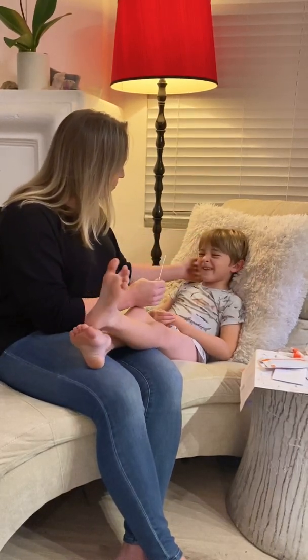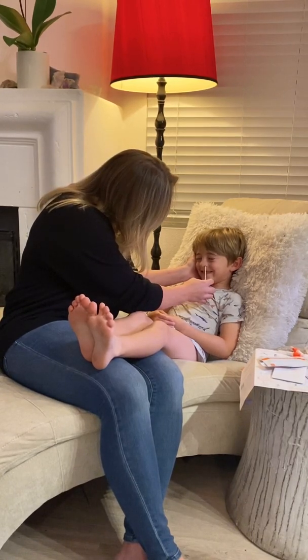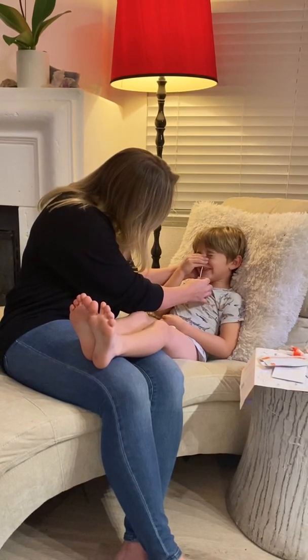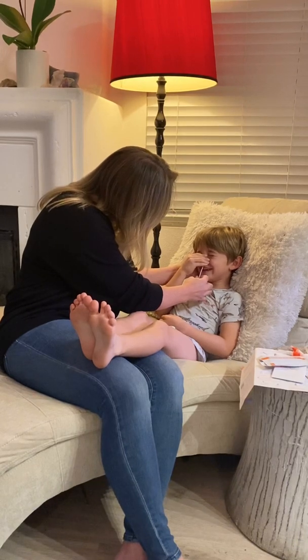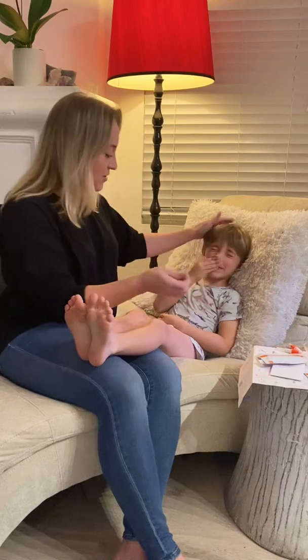Stay nice and still for me, look at one point. We insert the swab and rotate it five times — one, two, three, four, five. Good boy.